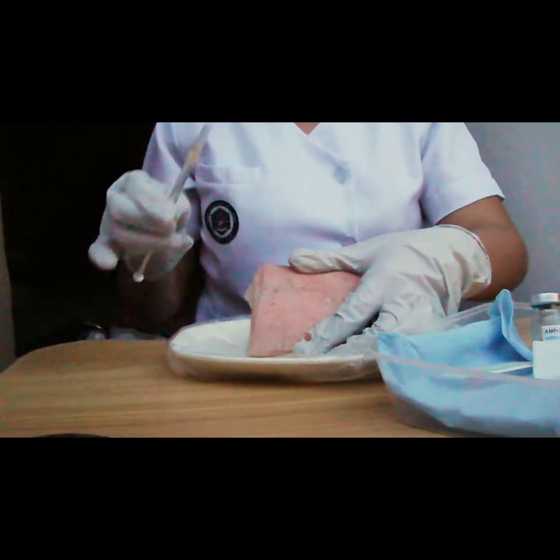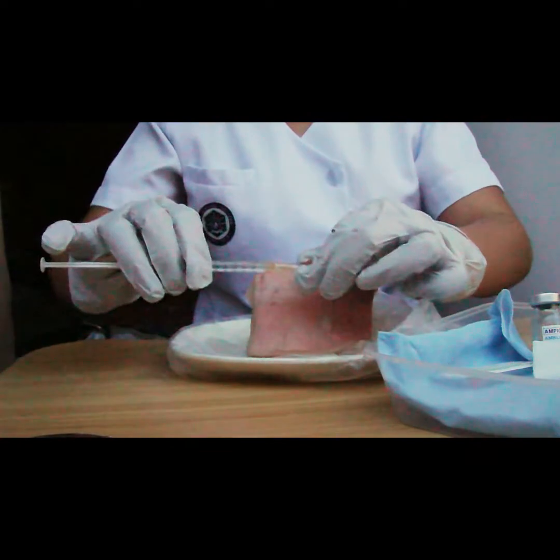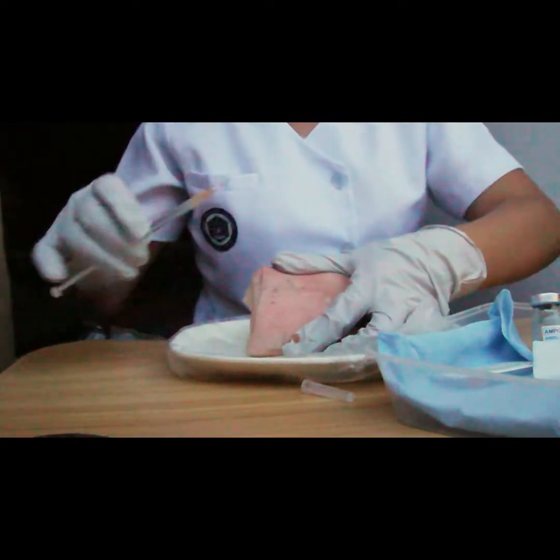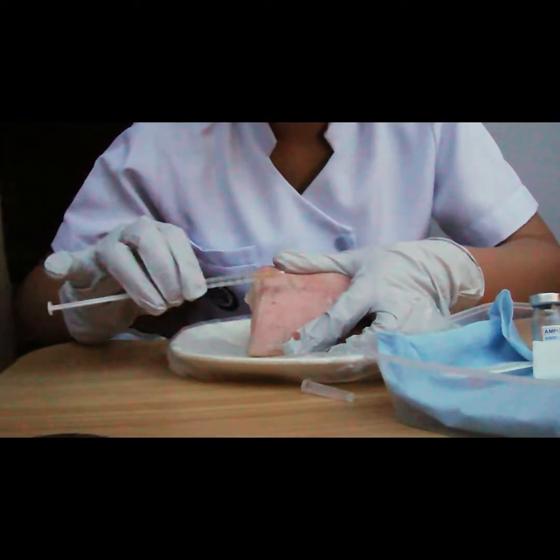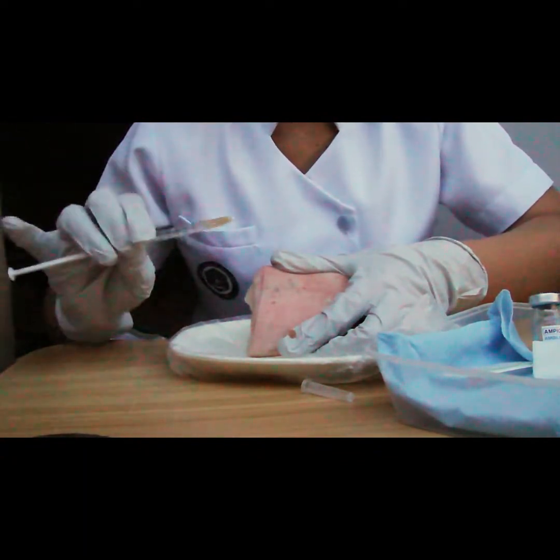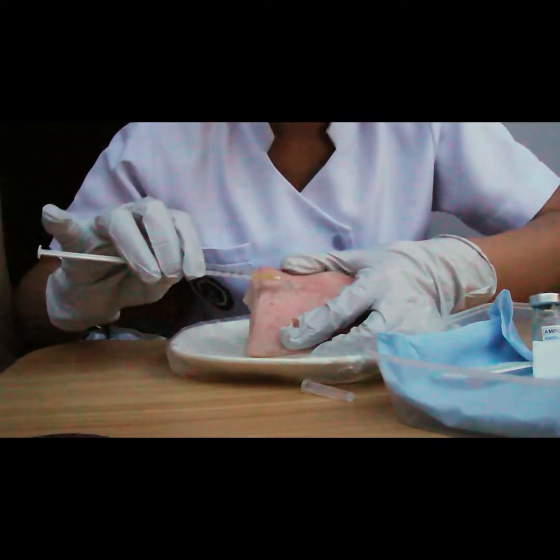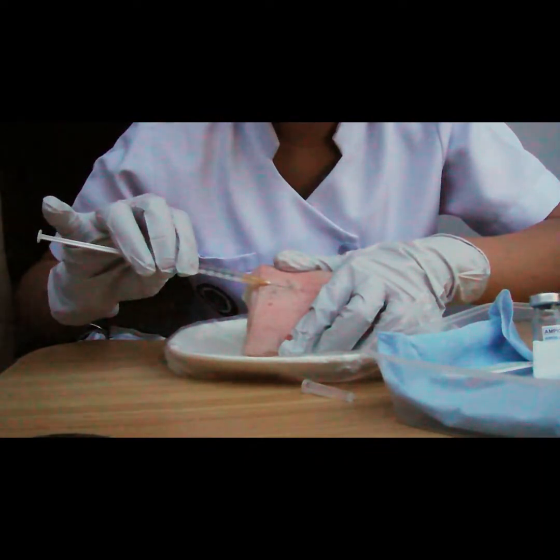Hold the needle almost parallel to the skin surface, with the bevel needle up. The possibility of the medication entering the subcutaneous tissue increases when using an angle greater than 15 degrees. So, we're gonna inject the fluid.